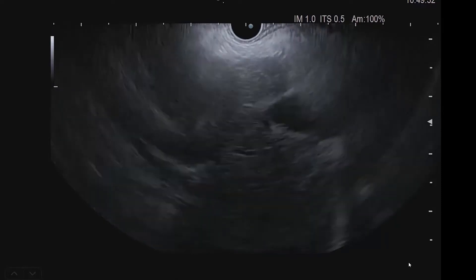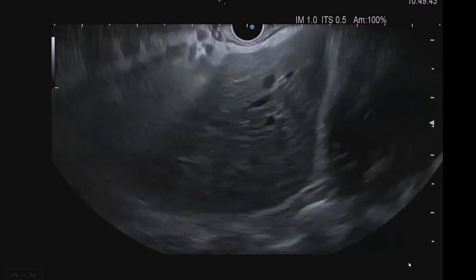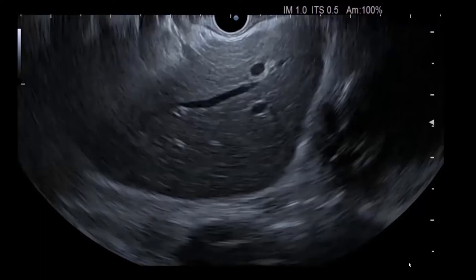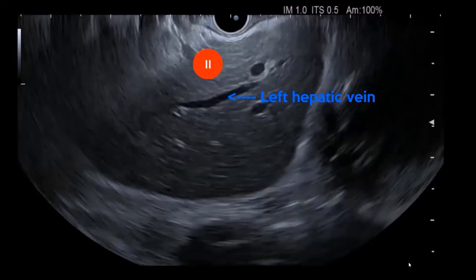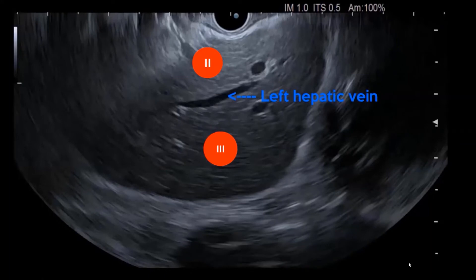If you perform a counterclockwise torque, you will find the left hepatic vein. The left hepatic vein is another important structure because with it, you can identify two additional liver segments: segment 2 above the left hepatic vein and segment 3 below the left hepatic vein. The left hepatic vein is important because it is one of the veins in which the puncture will be performed.